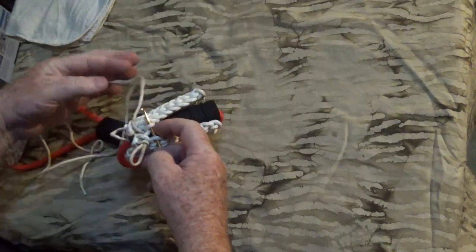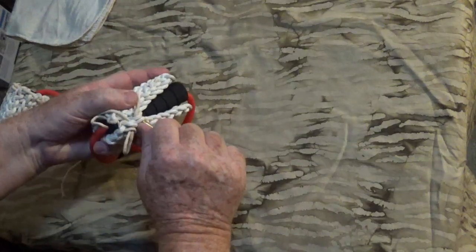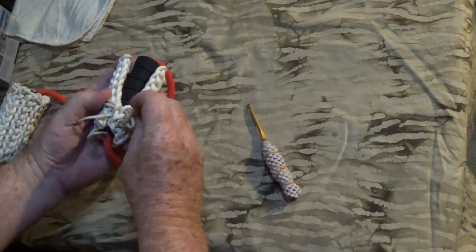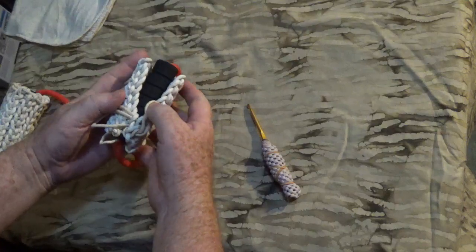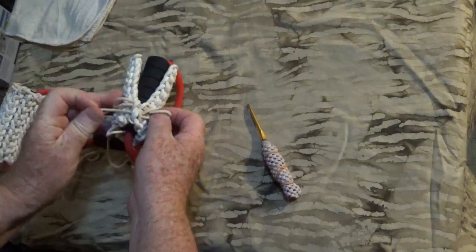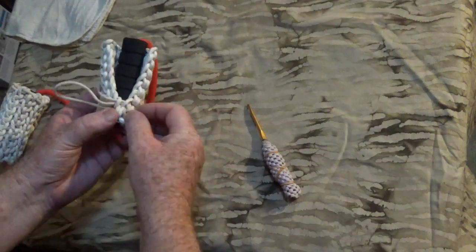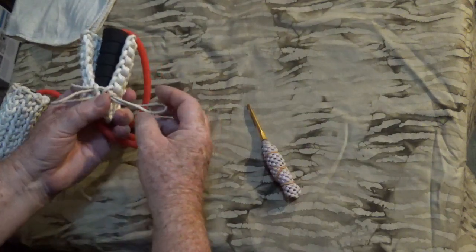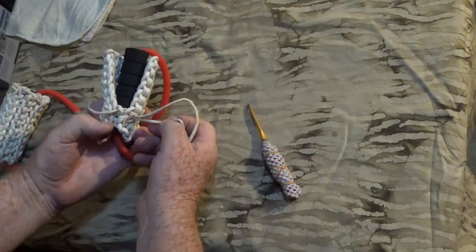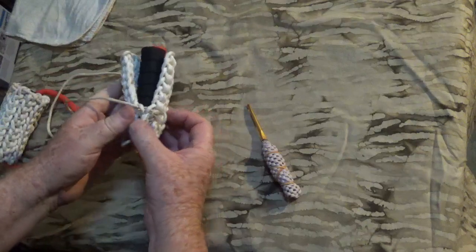Go through, bring the standing end of the cord up on top, hook on, pull it through, then bring it down through, and then hold that, and then it's the same pattern. This bottom is going to tighten the grip up around the new loop. Now that's tight. Now use the bottom, pull through, tighten up the previous loop, then slide it to a comfortable diameter.